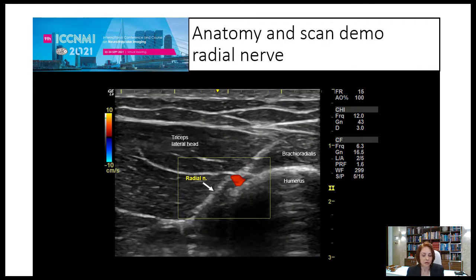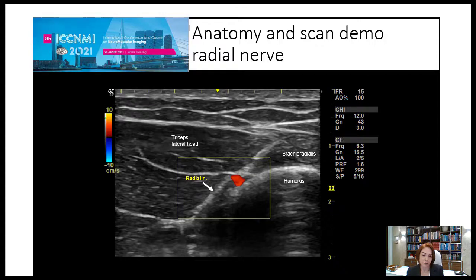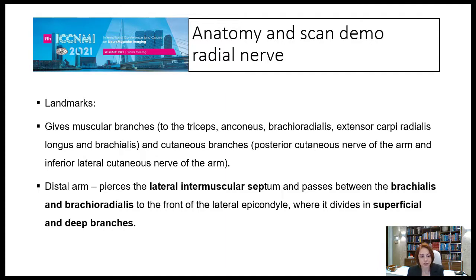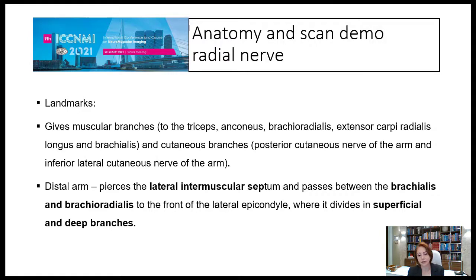It's always helpful to localize the artery using color Doppler, because sometimes it's not that clear, and you will need this landmark to guide you. During its trajectory in the arm, the nerve gives muscular branches to the triceps and anconeus, brachioradialis, extensor carpi radialis longus, and brachialis, as well as cutaneous branches — the posterior cutaneous nerve of the arm and the inferior lateral cutaneous nerve of the arm.